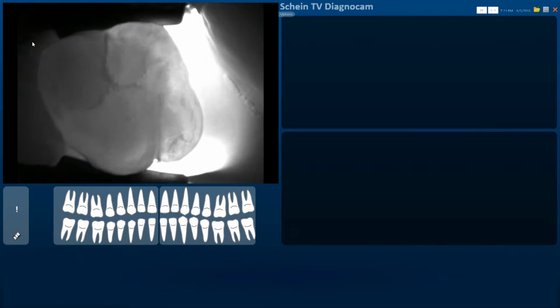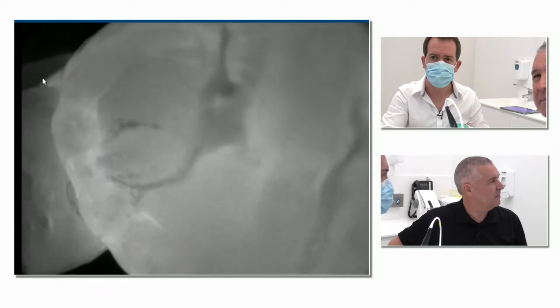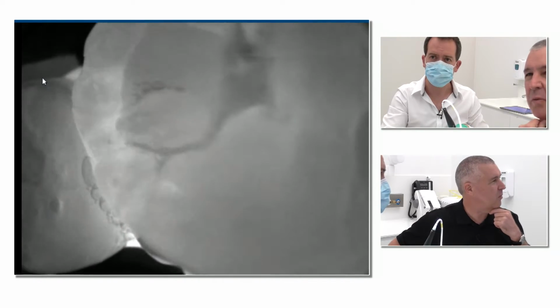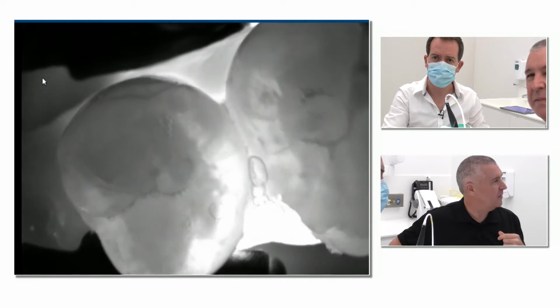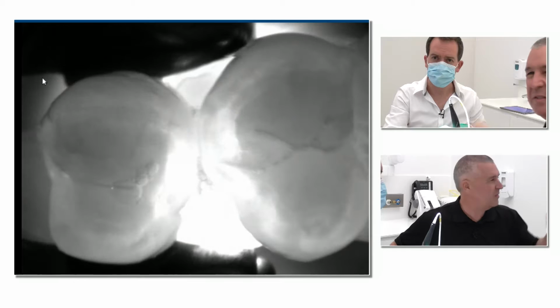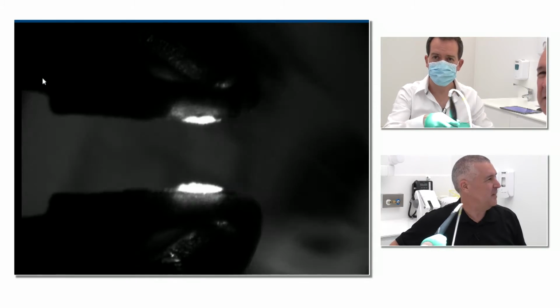So when you are using DIAGNOcam, these two little soft rubber edges move around the side of the gingiva. If you've got material in the fissures, such as fissure sealants, they almost always show up really, really well. You can see some bubbles of saliva. Here you can see really nicely the central core of the tooth, which always looks dark, and we can see this beautiful rim of enamel, almost as if we've taken a cross-section through the tooth here. Something I love showing to patients because it helps them to see what's going on.